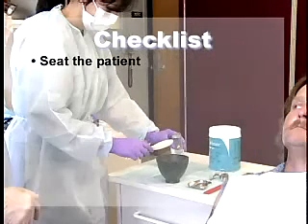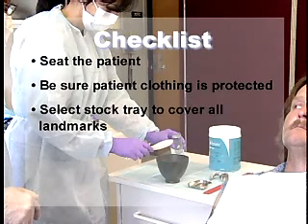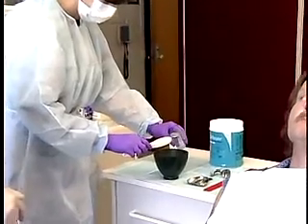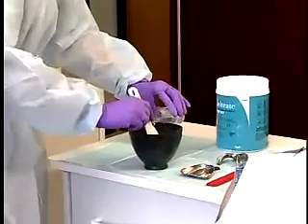Seat the patient and be sure the patient's clothing is protected with a napkin. Please select the stock tray that will cover all the landmarks indicating the denture-bearing areas. Check the impression tray and make sure it covers the hamular notches posteriorly. Deficient tray borders should be corrected by adding utility wax. Mix the alginate following the manufacturer instruction.